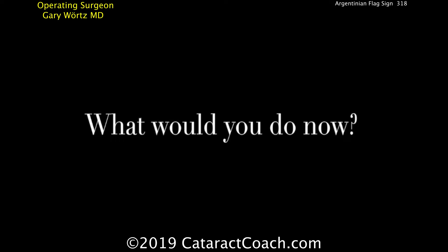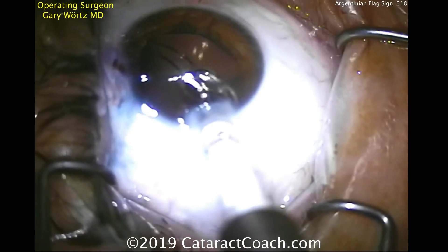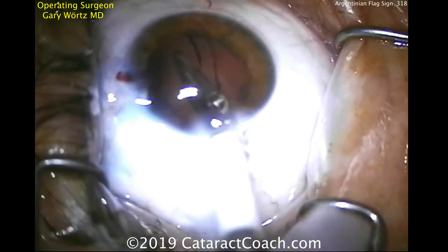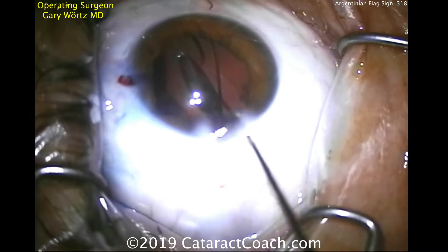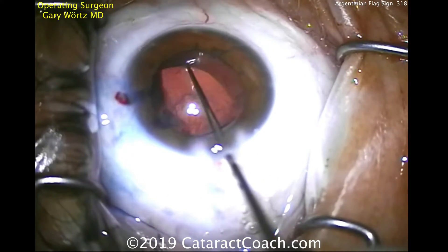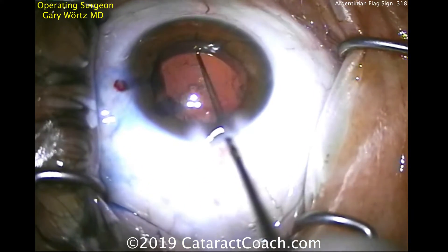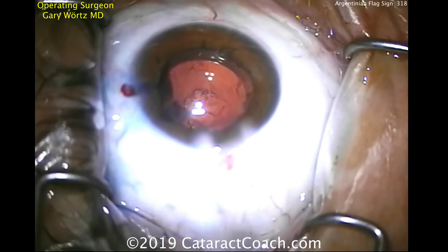So now what do you do? We're going to put in the IOL. What kind of IOL would you put in — a single piece lens or a three piece lens? The answer is you can do either. Here's the surgeon putting in a single piece acrylic lens. You just have to be careful not to exert forces on that capsule. If you did put a three piece lens in, you'd have more options for placement — if the capsule got damaged as you're placing it, you could dial a three piece lens into the sulcus. With a single piece lens, you really have to make sure it goes in the capsule bag, and that's what we see here.